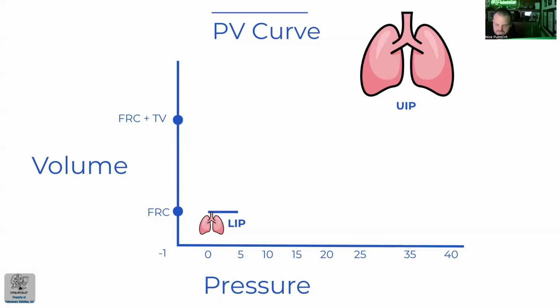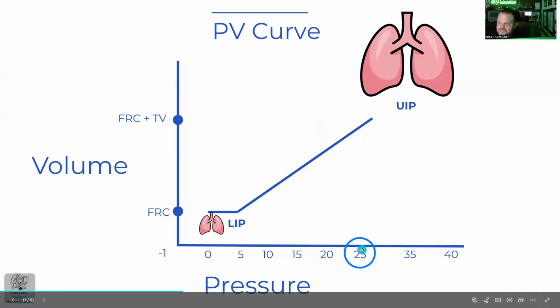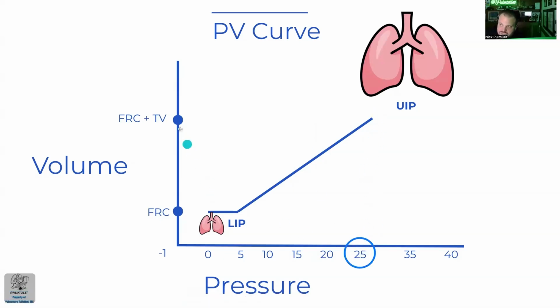I've said this multiple times before. I tend to accept higher volumes in patients with emphysema or COPD because we know they like to have bigger breaths but breathe slower. What you're trying to figure out by setting the PEEP is what is this straight line? If you are putting in volume, you're getting a step up in pressure linearly. So if you're on the straight part of this curve, you're not below the lower inflection point and you're not above the upper inflection point. Therefore, you're ventilating safely.